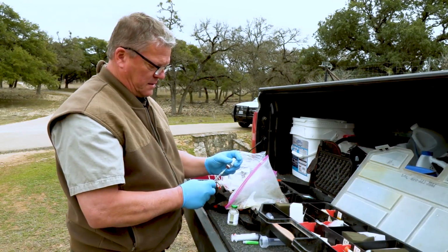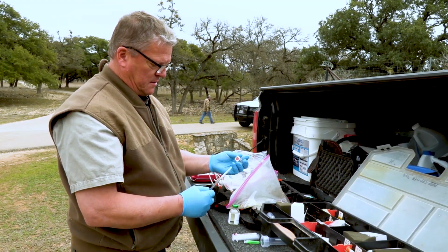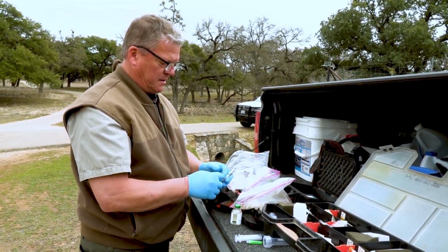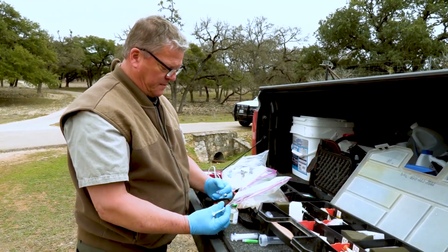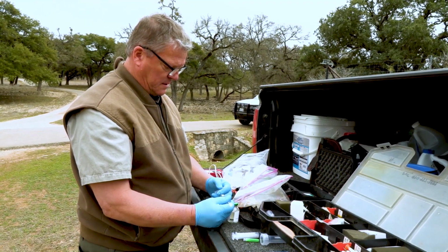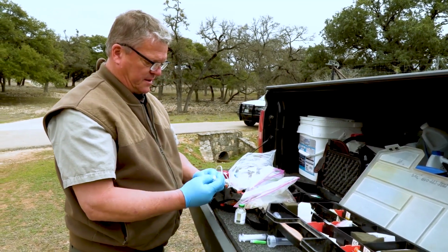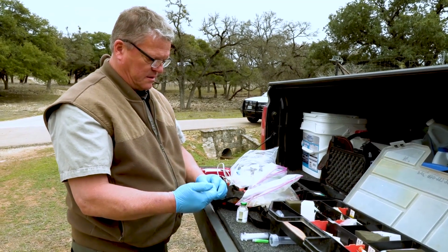When you're loading a dart, if you're using a lethal drug like this one, it's very important to handle the drug very carefully. And when you're loading the dart, be aware that it can splash out. You do not want a needle stick accidentally. It's important to use a long enough needle. And I usually turn the bevel of the needle away in case there's any splash out at all during the loading of this dart.